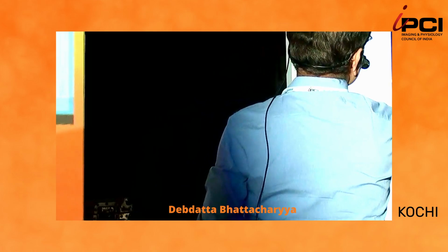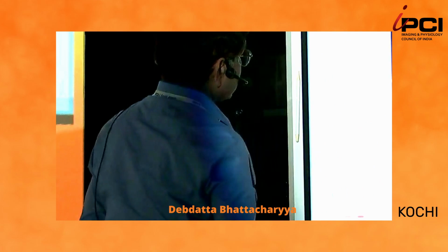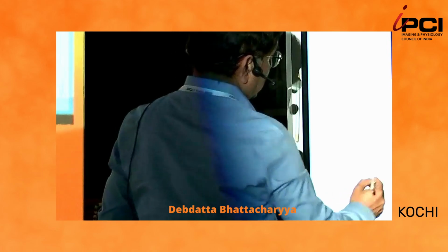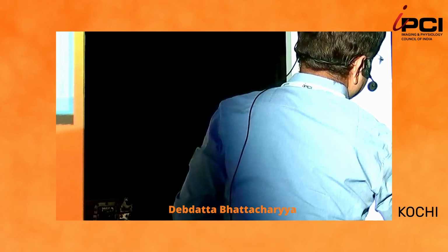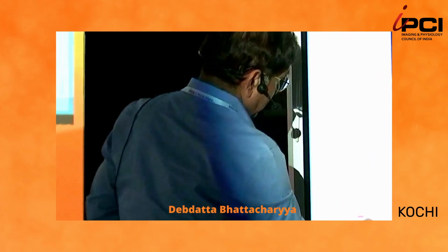So let's begin with the commonest artifact that you will find in every case, and this is the guide wire artifact. The guide wire throws a shadow, and sometimes the shadow is not very prominent, but sometimes it will be quite prominent, like here, shadow, and then here.